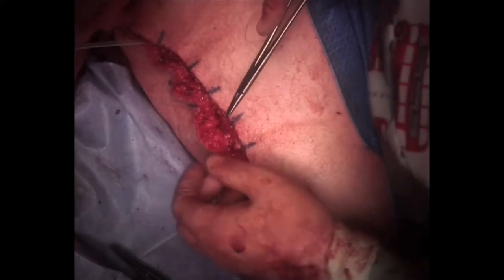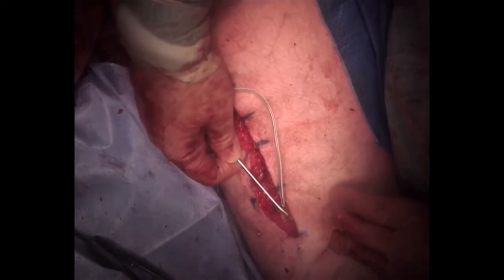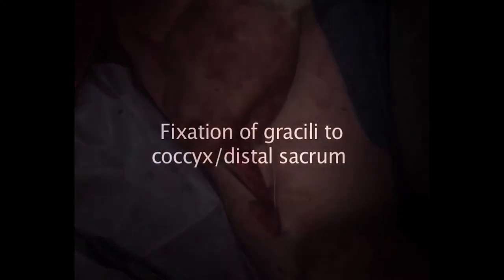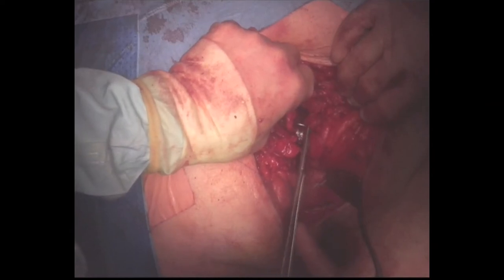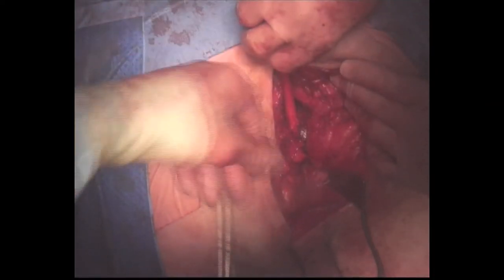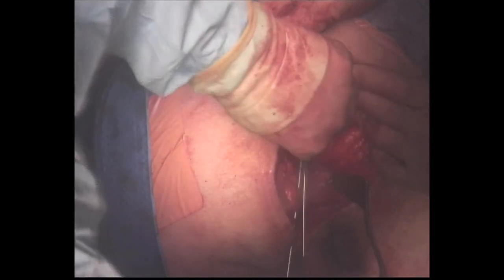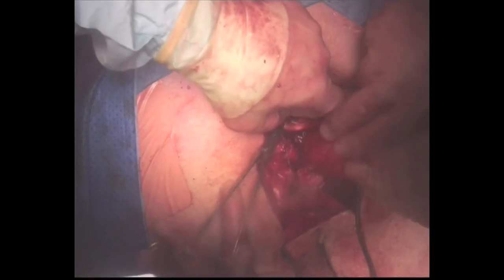The skin incision of the thigh is closed in layers with a subcutaneous 14 French gauge suction drain in place. The gracilis muscles are woven together and fixed to the distal sacrum and coccyx using 2-O monofilament permanent sutures. As gracilis is a unipennate muscle, the tendons lie centrally and the muscle bellies laterally, allowing the reconstruction to have a central tendon.